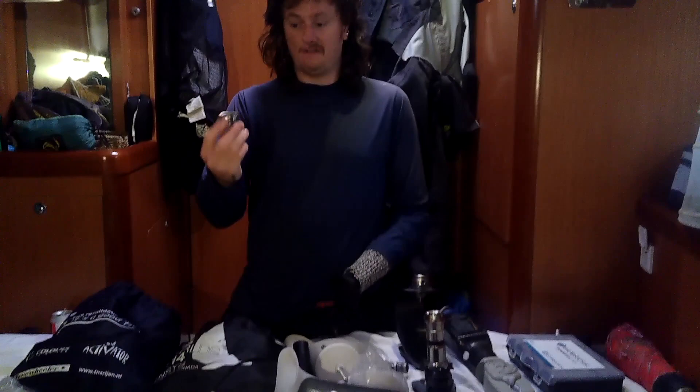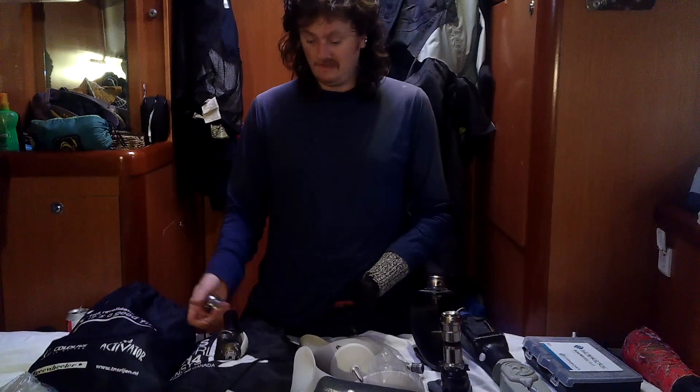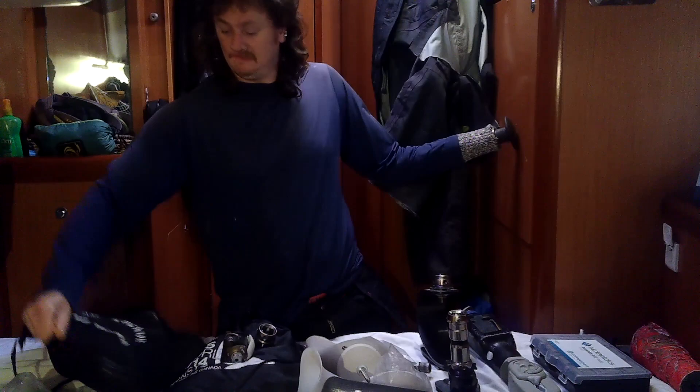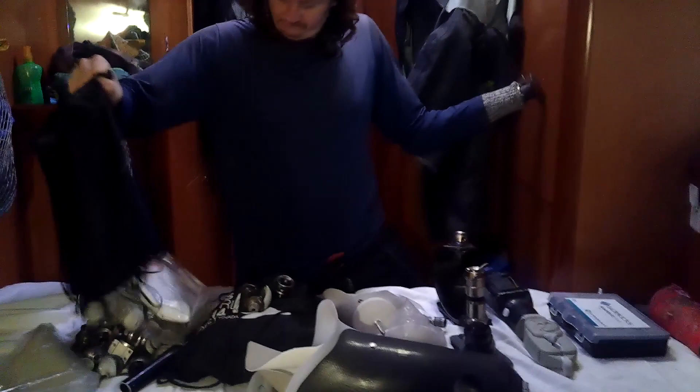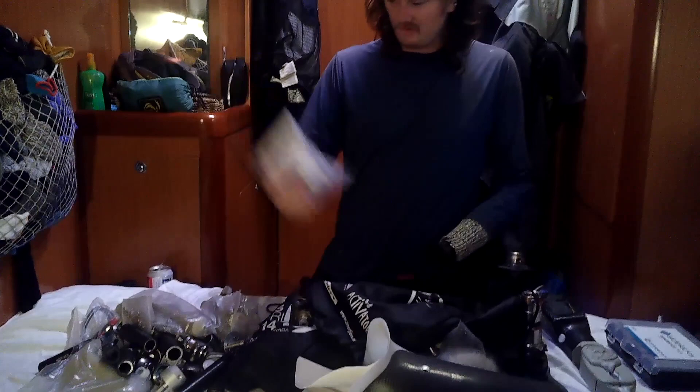I've got lots and lots of spares. I have my running legs in a bag behind me. The other day I mixed and matched all of these together and basically made a working set of running legs. This has basically everything I'm going to need: different hand fittings, spare socks for my legs, spare liners for my arms.